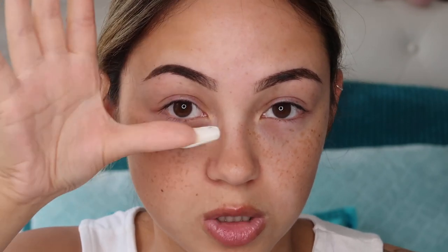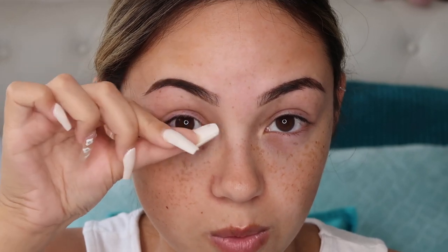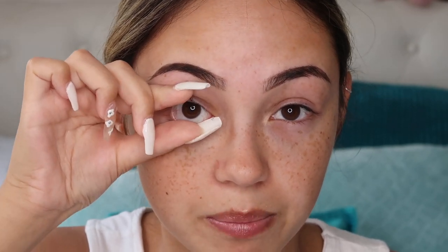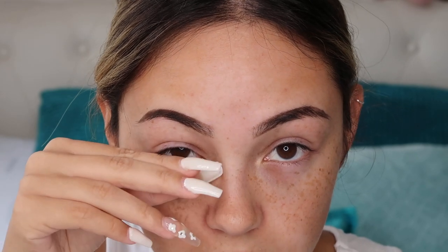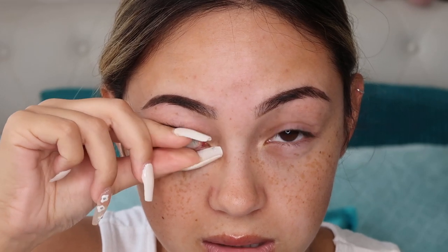How to take them out: you're going to use the side of your thumb and your finger to open up your eye like that. Then you have to pinch — this sounds awful — but pinch your eye. Obviously don't pinch your actual eye; I mean pinch the contact. Open your eye, then just pinch the contact.